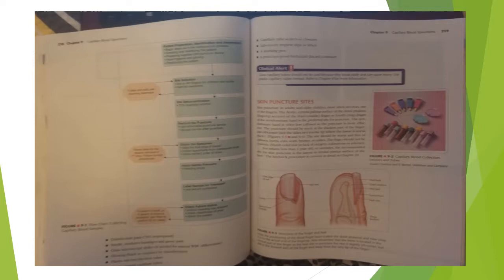The puncture should be made at the thickest part of the finger, just off-center, not the sides or extreme tip where the tissue is not as thick. The site should be warm and free of calluses, burns, cuts, scars, bruises, or rashes. The finger should not be cyanotic, which is bluish in color due to lack of oxygen, edematous, or infected.